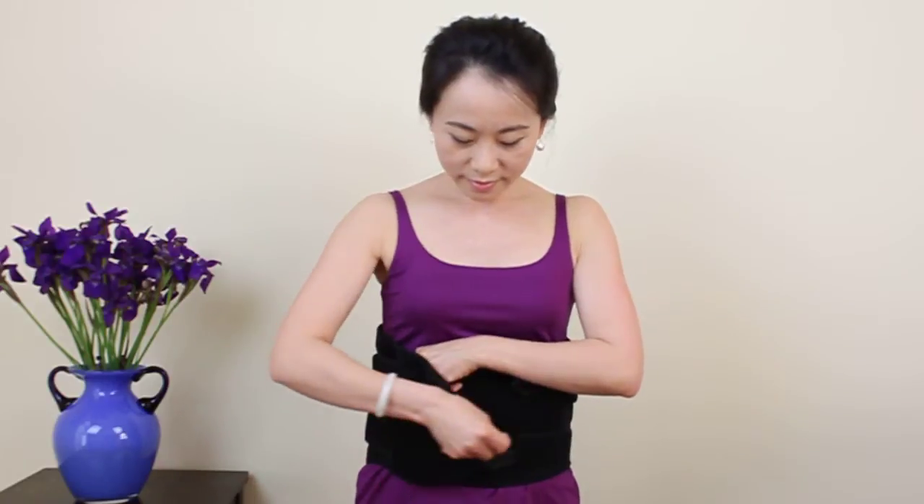Put the left anterior plate in the center against your abdomen and then place the right panel on top of it.